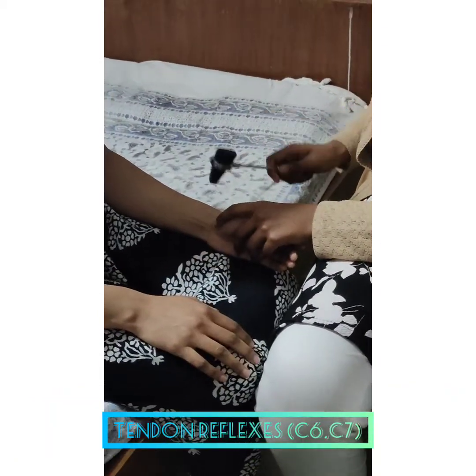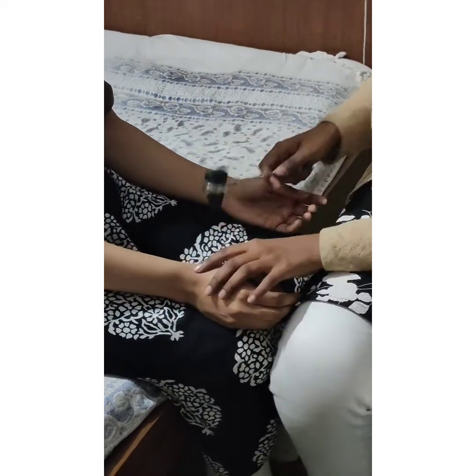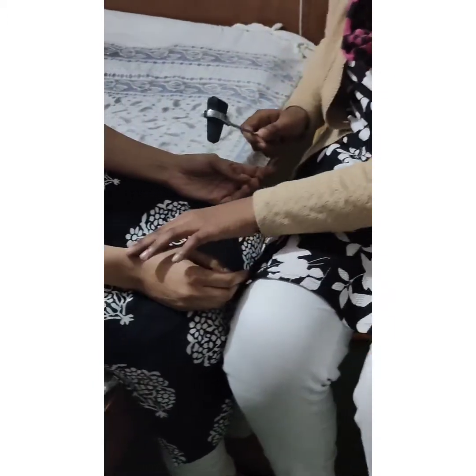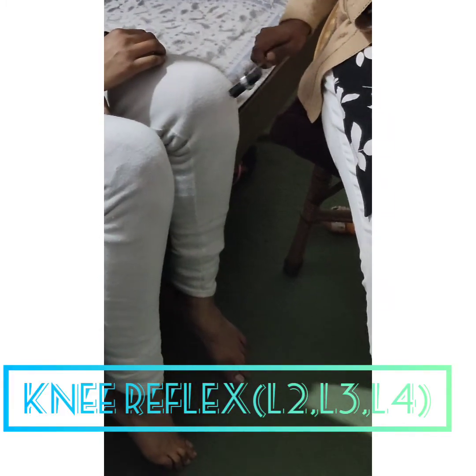With the patient in a sitting position, the arm should be partially flexed at the elbow with palm down. Place your thumb or finger firmly on the biceps tendon. Strike with the reflex hammer so that the blow is aimed directly through your digit toward the biceps tendon.